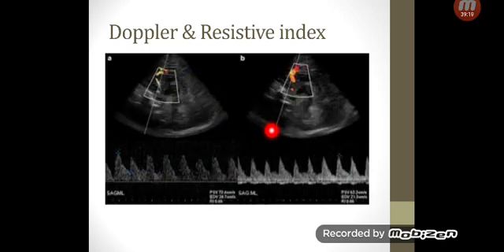Again, to show it again. You can get it anywhere in the artery, but it's always good to have it parallel, because as you can see here, he had the study somewhere where it wasn't that parallel. You can see that the wave wasn't really good. Then he adjusted and the wave became more pronounced.